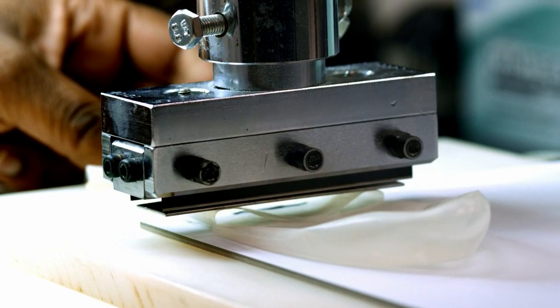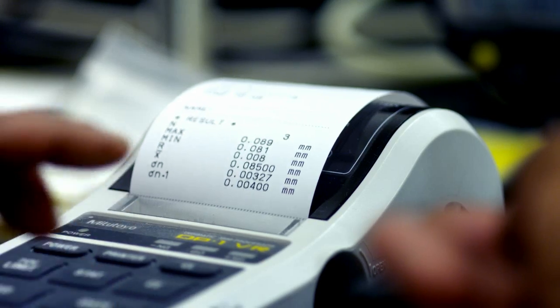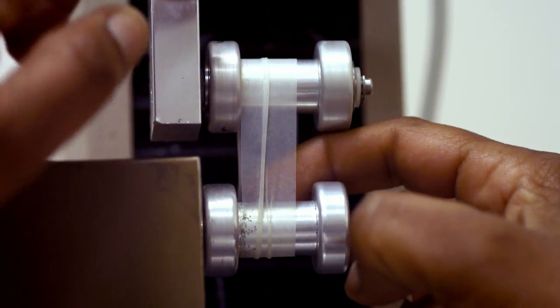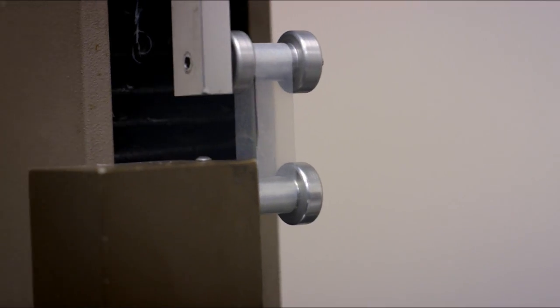This next test here, which we call the tensile test, stretches out the width of the condom to see how far it can enlarge and how strong it is. Most condoms stretch to over 750% of their original width.